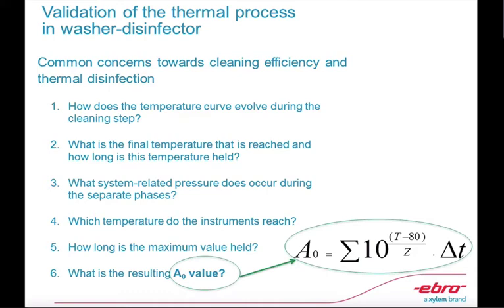Moving forward, now we talk about validation of the thermal process in washer disinfector and how it is supposed to be performed properly. These questions will help you with implementing a good procedure. Number one, how does the temperature curve evolve during the cleaning step?